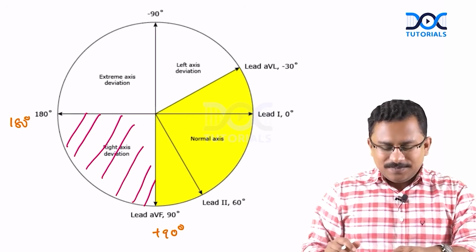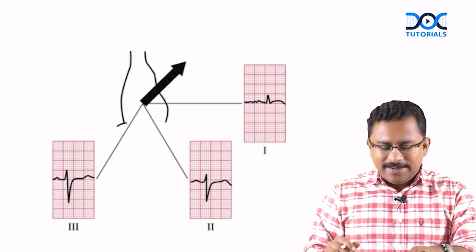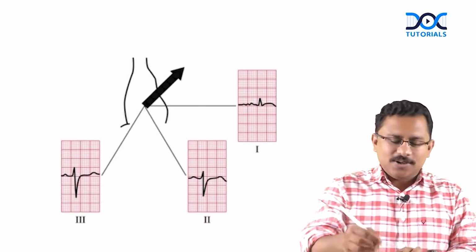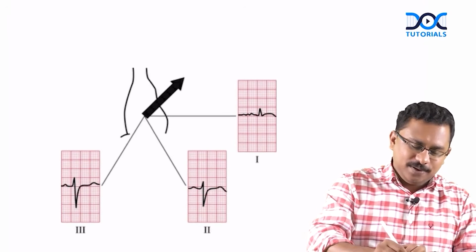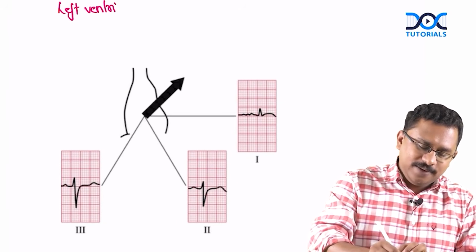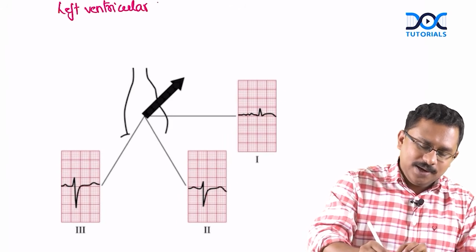Next, let me tell you another scenario where the patient has left ventricular hypertrophy.